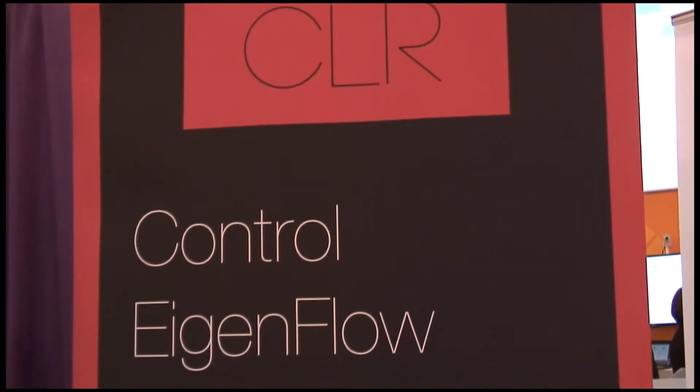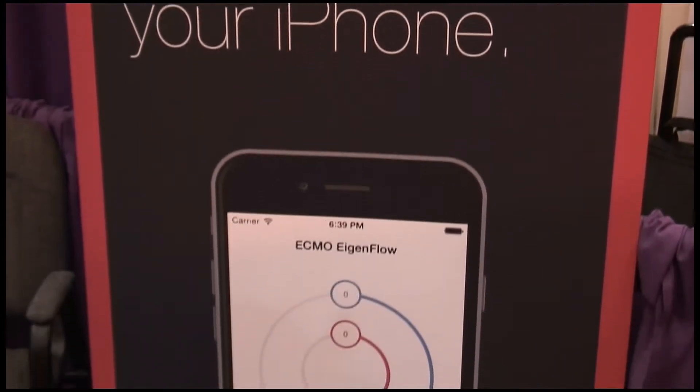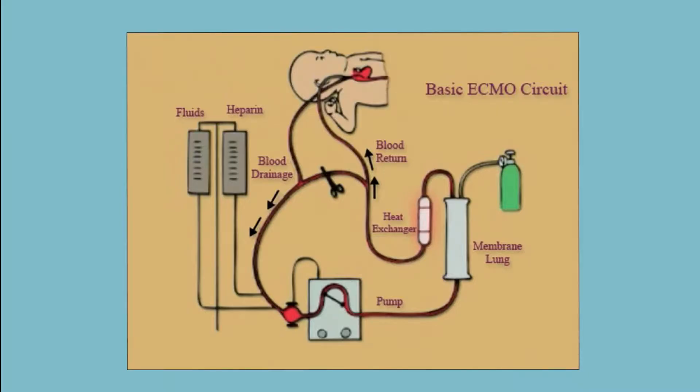We originally took the idea of using an existing mannequin, whether it be a newborn or an adult mannequin, and we would take an existing ECMO circuit that the provider would have, modify it so that way you can change the resistance values in the circuit itself.